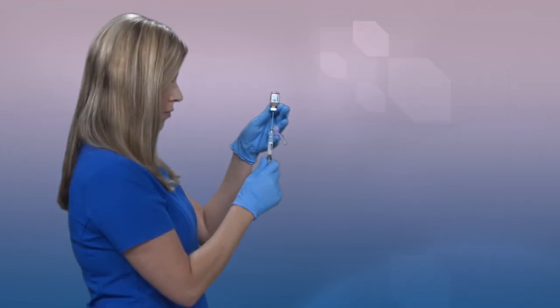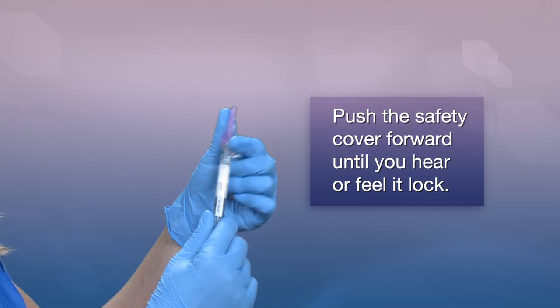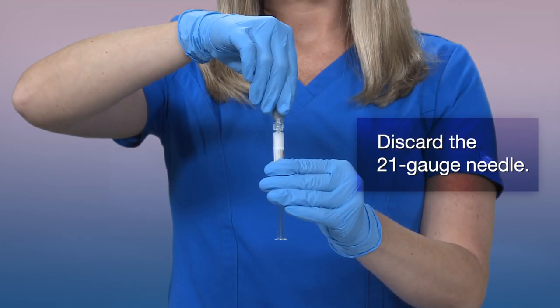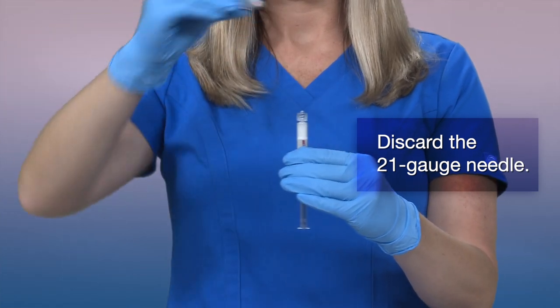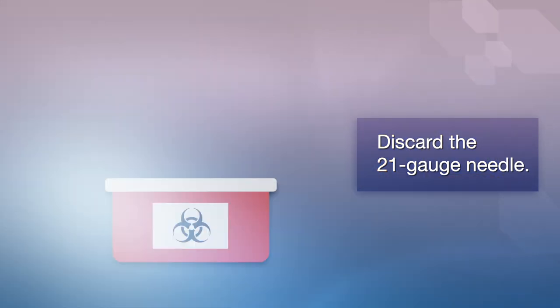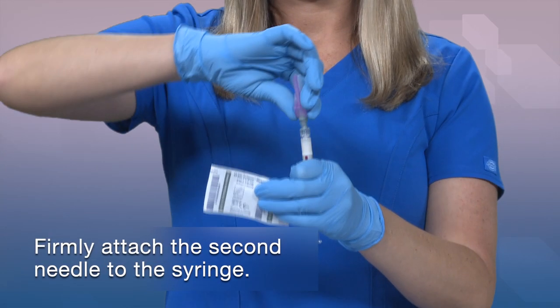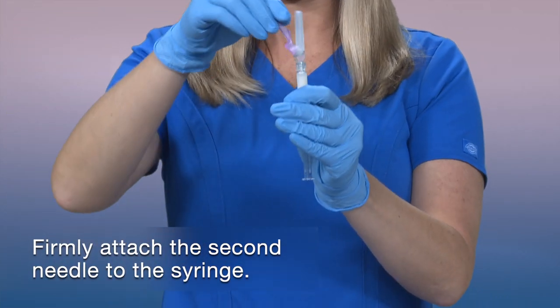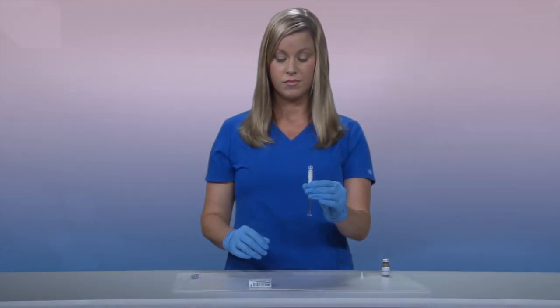Once the suspension is drawn into the syringe, remove the needle from the vial and push the safety cover forward toward the needle until you hear or feel it lock. Then remove the first 21-gauge needle by grasping the needle hub to disconnect the needle from the syringe and discard it. This first 21-gauge needle will no longer be used. Step 4: Administer suspension. Firmly attach the second sterile needle onto the syringe with a push and clockwise twist and pull back the safety cover towards the syringe.